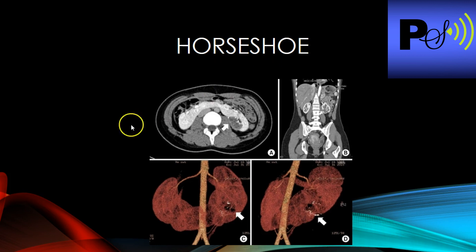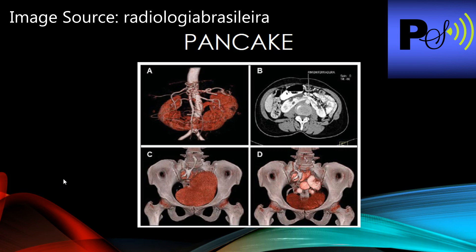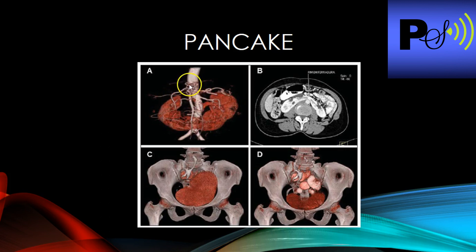Here's a patient with a horseshoe kidney — you can see one renal artery on each side, and the left dips down to where the horseshoe kidney is. That shouldn't be too hard to scan. This patient has a pancake kidney — the kidney is in the bottom of the pelvis with multiple arteries present, which could make finding a stenosis quite difficult.